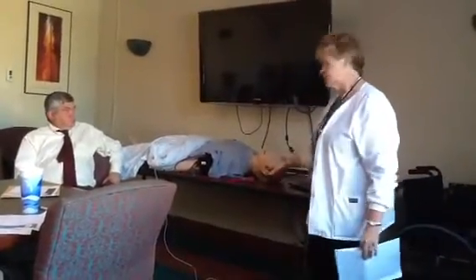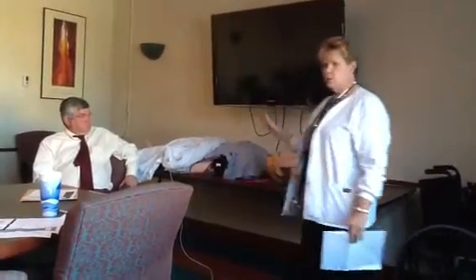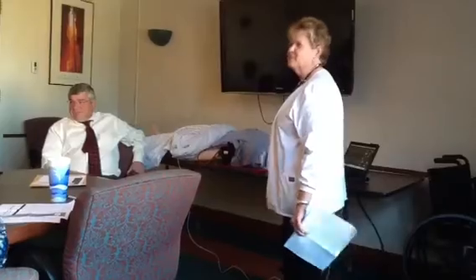Kevin has, and he's going to control what SimMan does. So he makes him blink, breathe, move, talk, groan, whatever we want him to do, he can do. We can change his heart tone. Go ahead, Kevin. Give him a little demo.